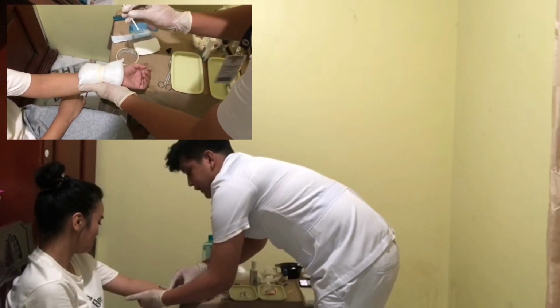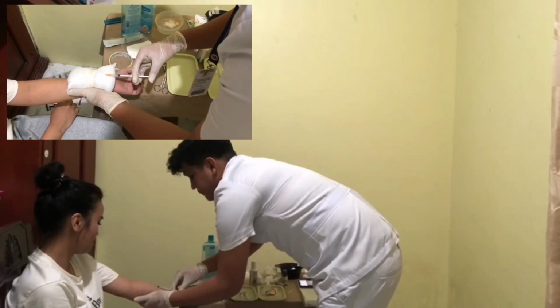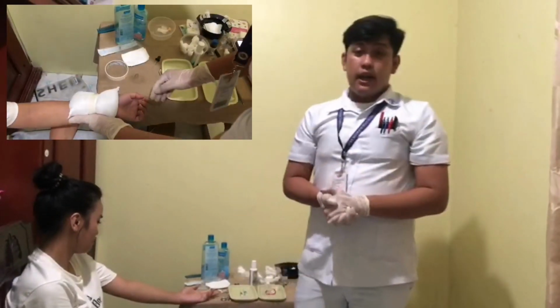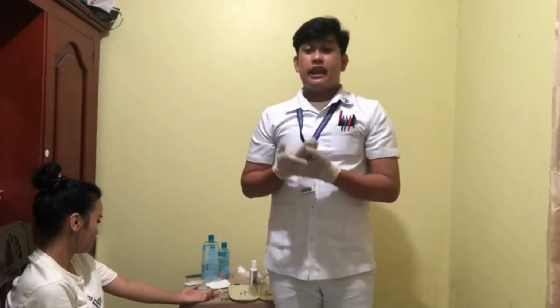Five to 15 degrees. Okay, perfect. And then discard the used cotton. And then we should be careful not to massage the area to avoid hurting the patient and infecting the site.